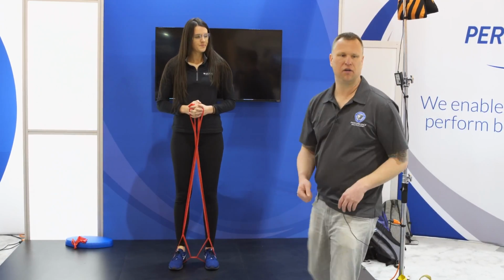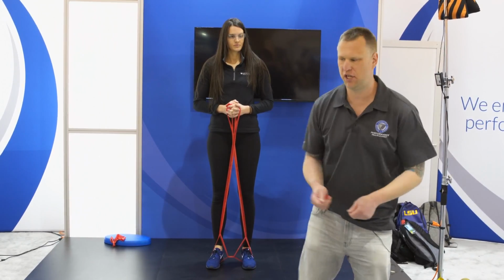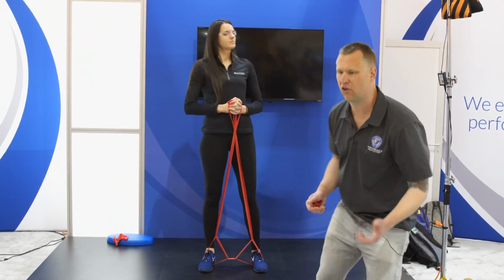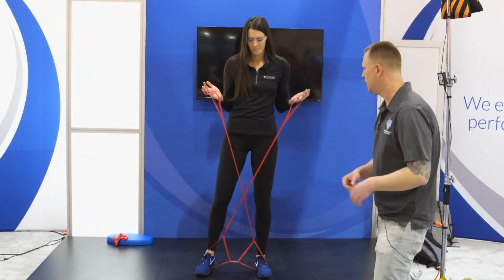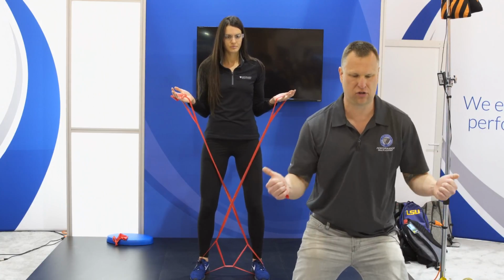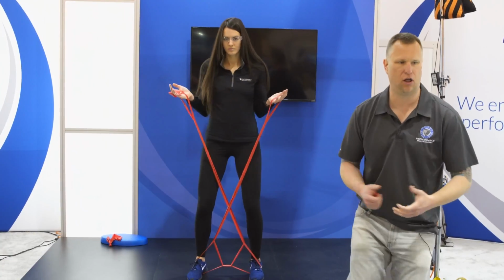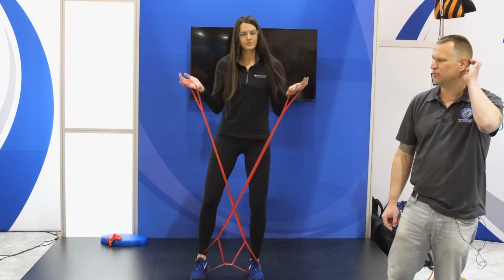Could I then work, let's say she's coming in and she's a cashier, and she's having hip and back pain as she's moving things in a cashier at a grocery store. Maybe it's not that simple. Maybe they're an athlete and in defensive things, soccer recovery, basketball drop step for recovery, things of that nature, volleyball recovery. So I can teach these kind of dynamic hip motions by having her come into this squat here. She's controlled with her arms, and we can do isolated drop steps. And you can decide how much knee flexion do I want to do, how much load do I want to do. Again, I'd like you to consider the functional mechanism of what we're trying to do.